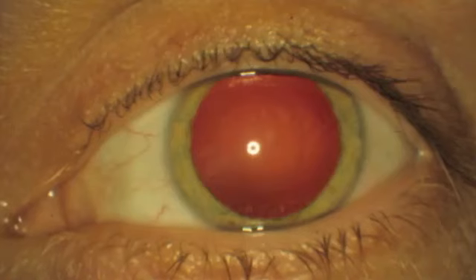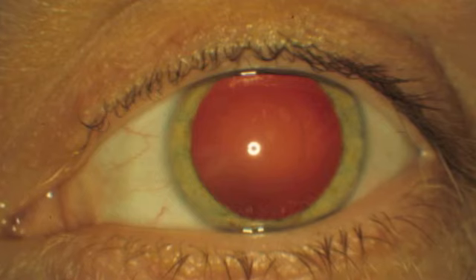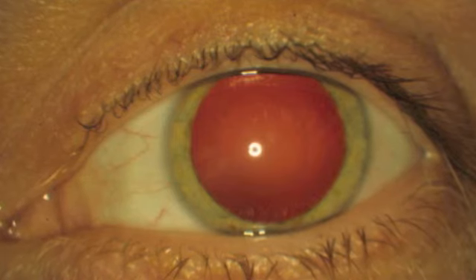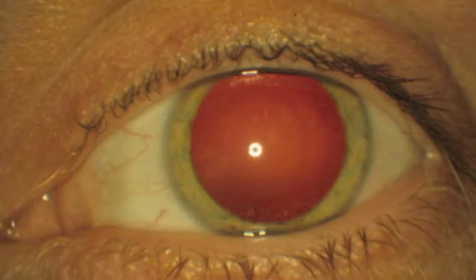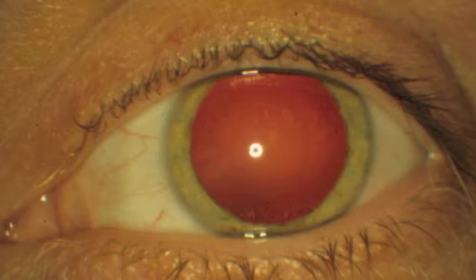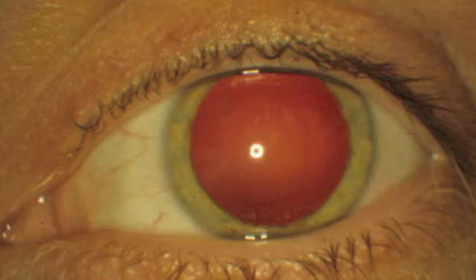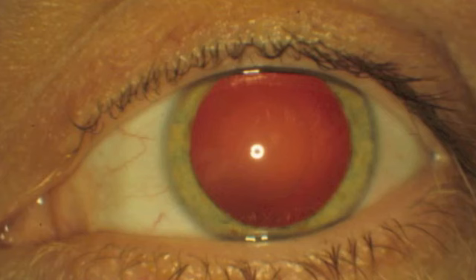Although it has long been called the red reflex, what is seen in the ophthalmoscope as light reflects back to the examiner from the inside of the eye often appears yellow, orange, or red, or a combination. Here is a normal red reflex. Eliciting the reflex requires the light to be able to travel unobstructed through clear, colorless ocular structures and fluids, the cornea, aqueous humor, lens, and vitreous. A normal red reflex requires clarity of each element.